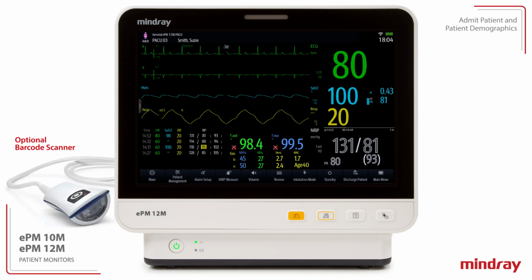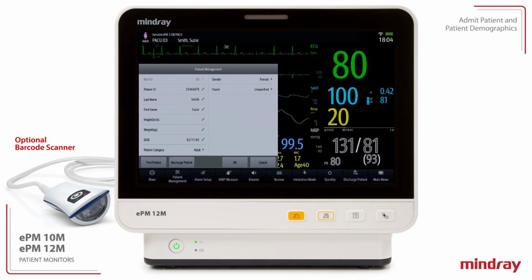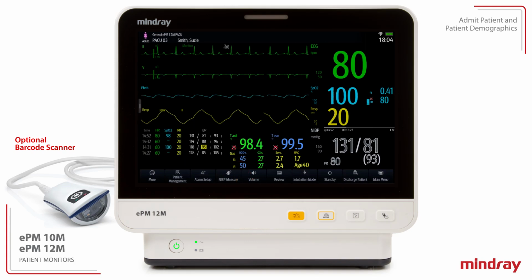The optional barcode scanner may be used to populate the demographic fields in the Patient Management dialog. Scan the barcode on the patient identification bracelet. Review the information populated in the Patient Management dialog, and select OK to confirm and return to the main screen.